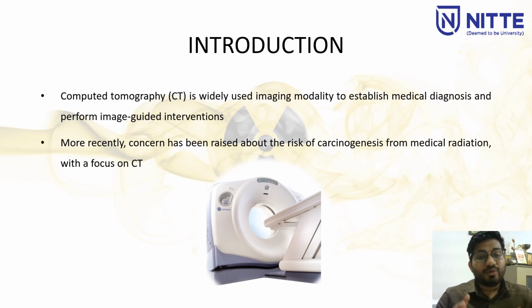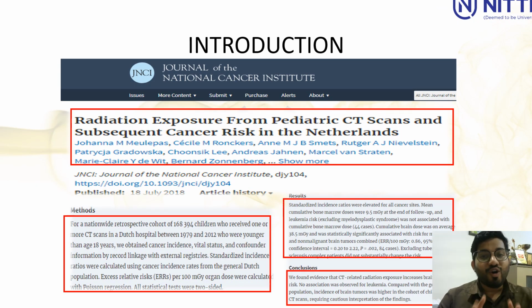Computed tomography is a widely used imaging modality to establish medical diagnosis and perform image guided interventional procedures too. More recently, concerns have been raised about the risk of cancer from medical radiation, with a focus on CT scans. When you look at modern research and paper cuttings, you can see a lot of articles coming out about the radiation risk of diagnostic imaging, specifically focusing on CT.